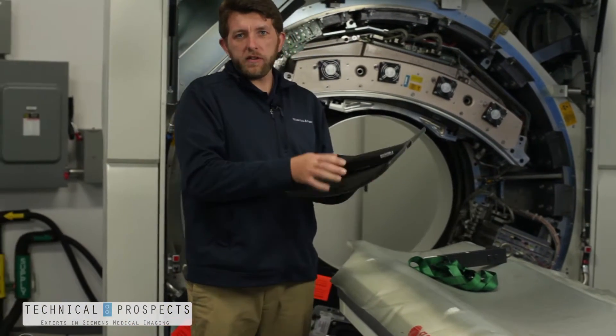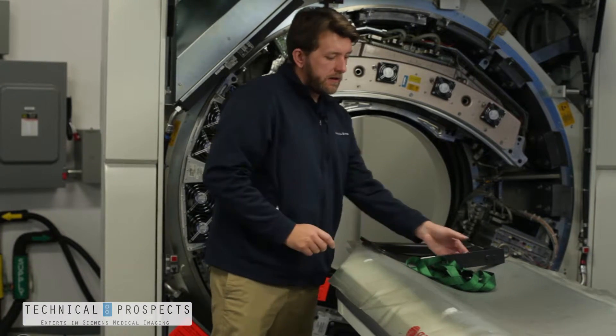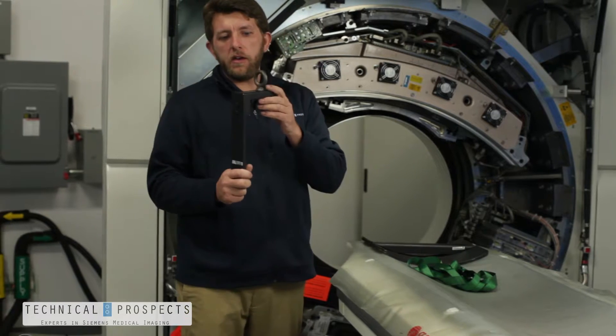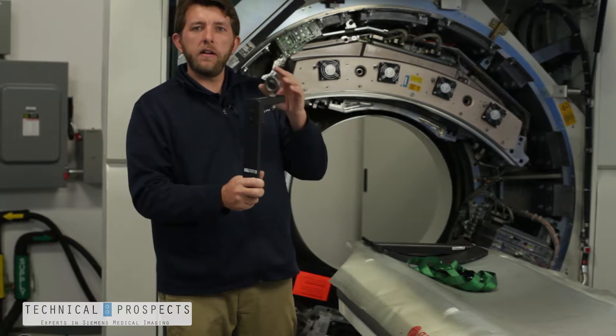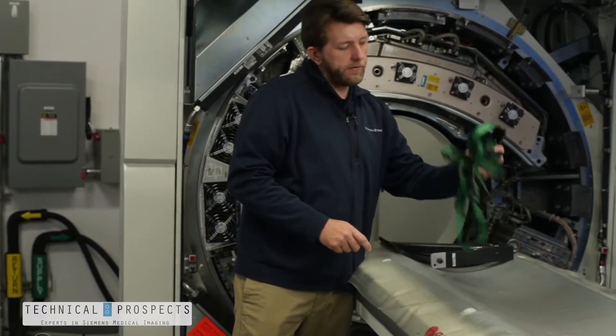You have this table bracket which lays on top of your Sensation table at the head end. The next piece is your tube bracket where you would hook the strap assembly to. Finally we have your strap.